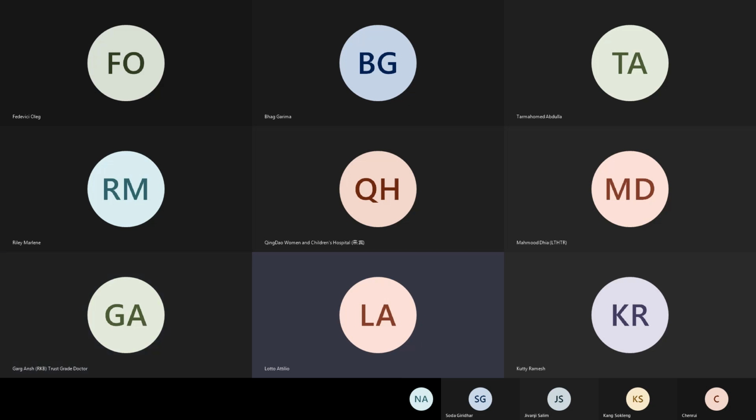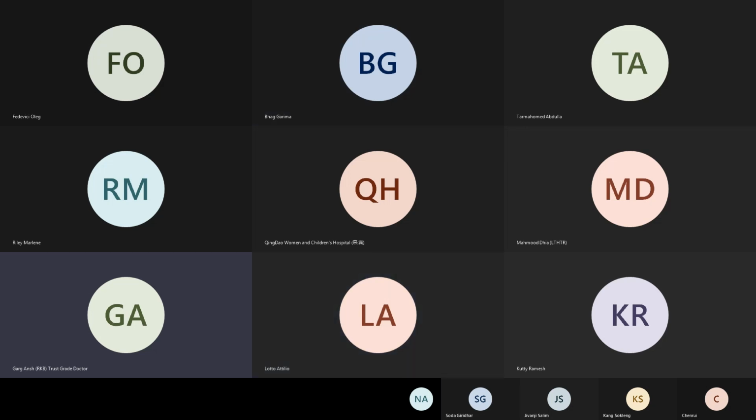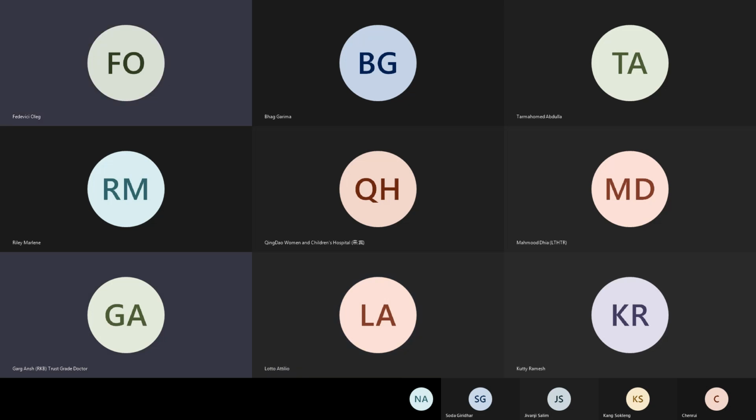fill that. And sometimes I found it very difficult when there are loads of chordae, even in moderate size VSDs, where there are loads of chordae and thick chordae, I find it difficult to slot the patch. I'm sorry, there is some background noise. Okay. So I find it difficult to slot the patch underneath those chordae. Hence, I use the single patch technique. Thank you, Tilio, for your comment.